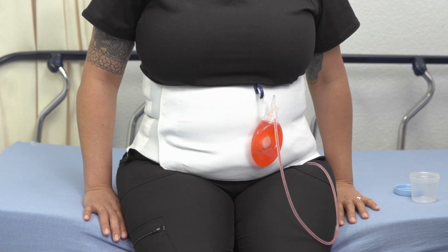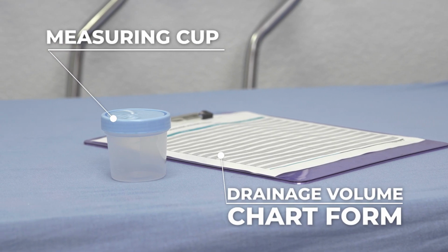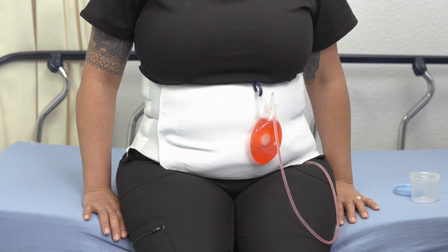You're going to gather all your supplies before you perform this task. You need to make sure you have your measuring cup and the drainage volume chart form. Once you have everything staged, make sure that the patient is in a comfortable position. The best position is either sitting, as the patient is now, or lying down.